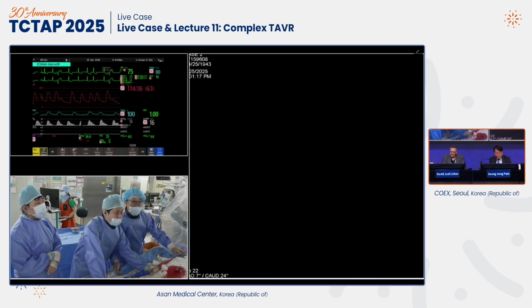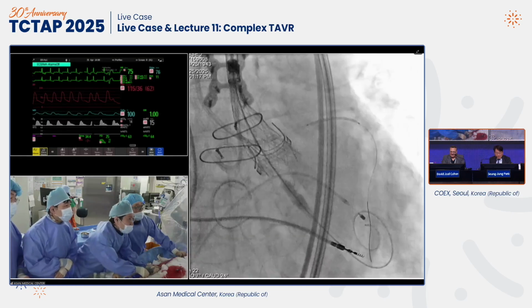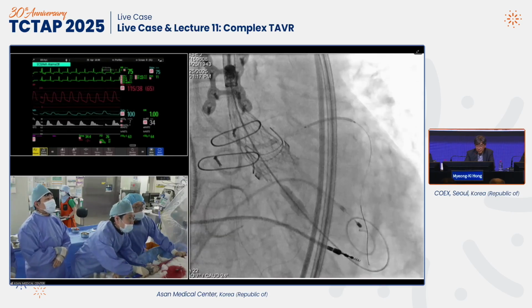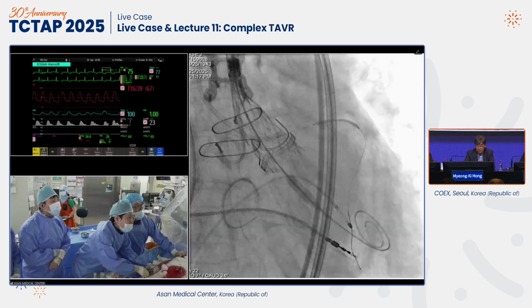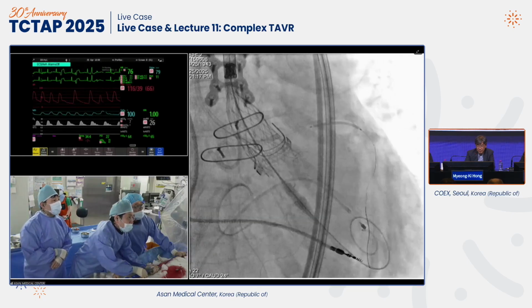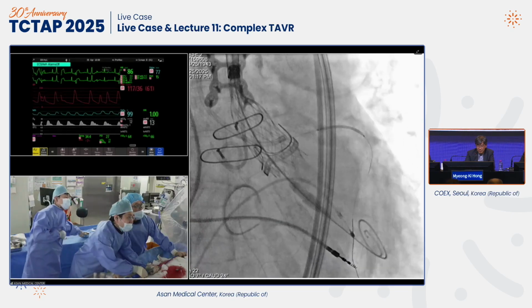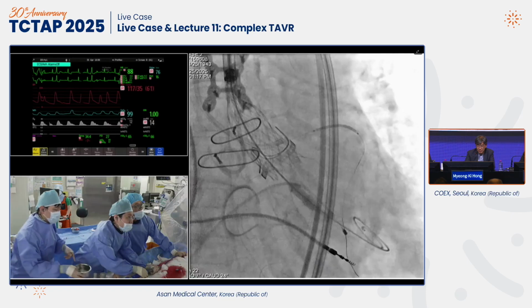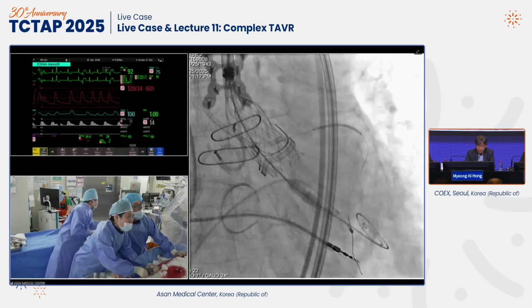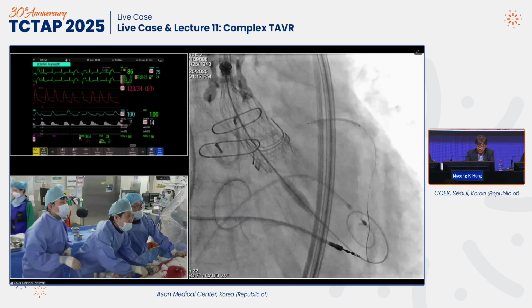Yeah, so I think position-wise is good. So we're going to try to do the release over here finally. More slowly. Yeah, release. More slowly. I like the tension release. Okay, release, more slowly. Release. You can't go too slow. Okay, tension release. Right. Okay, release. Still. Okay, release. A little faster.